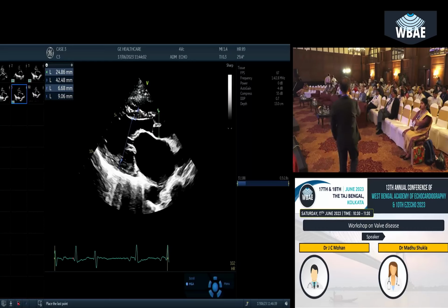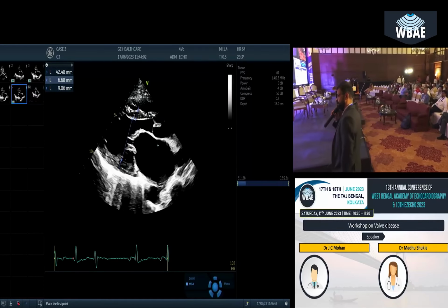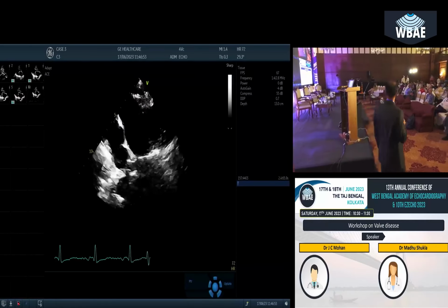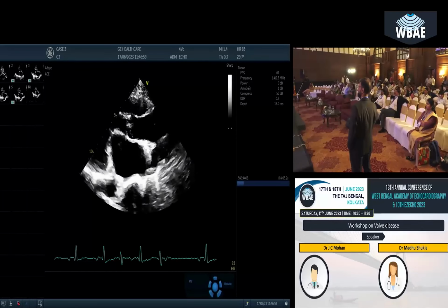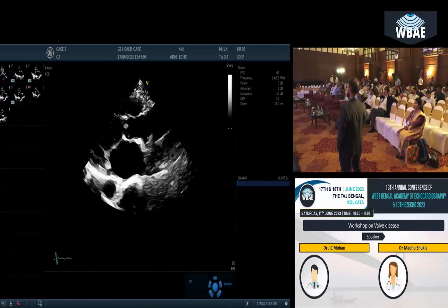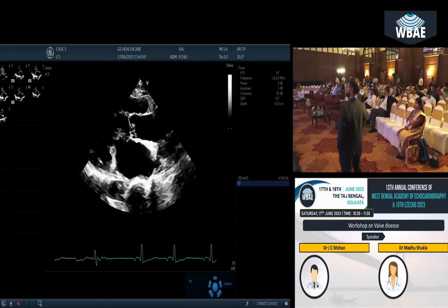So for the aortic apparatus, the LVOT or the aortic annulus is in the phase of mid systole. Can we have another view for that? Just bring more of aorta. Take one different image. Yeah, more. That is better. Good. There is more of aorta, more of left atrium, more of right pulmonary artery now. Right pulmonary artery is also dilated, usually because of hypertension.